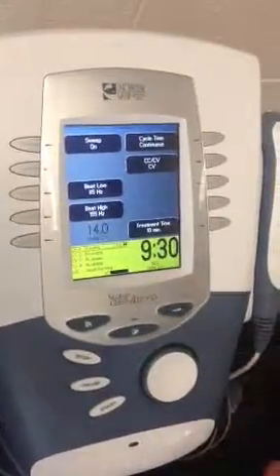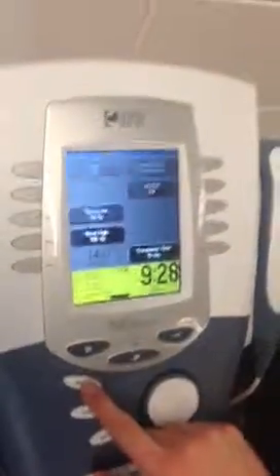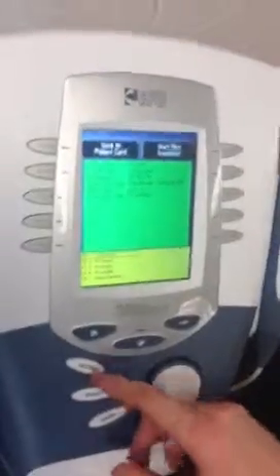Okay, that would be premod. So we'd stop the treatment. And during this time, as with interferential, you'd want to record the treatment parameters, make sure that you know what worked for them in the past to keep a record. That might help them in the future.